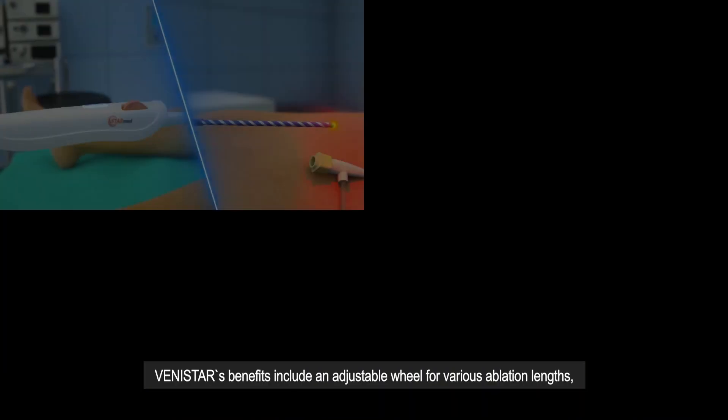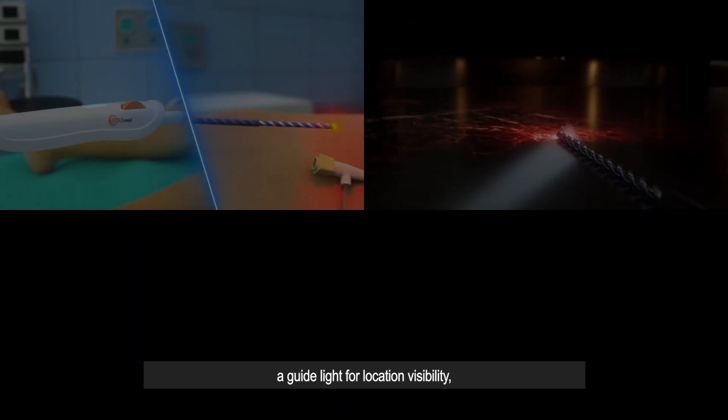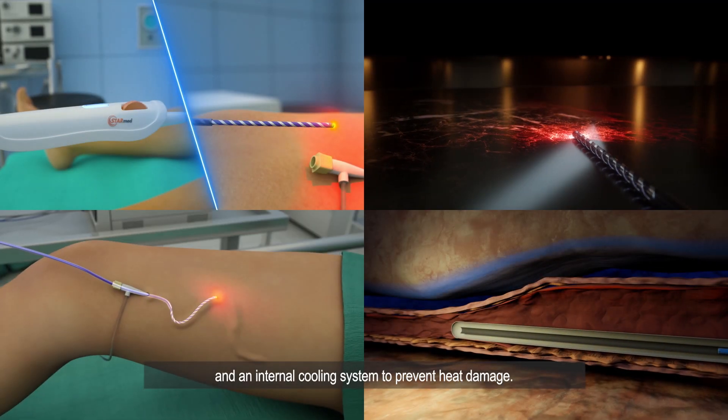Vinistar's benefits include an adjustable wheel for various ablation lengths, a guideline for location visibility, a spiral active tip for flexibility, and an internal cooling system to prevent heat damage.